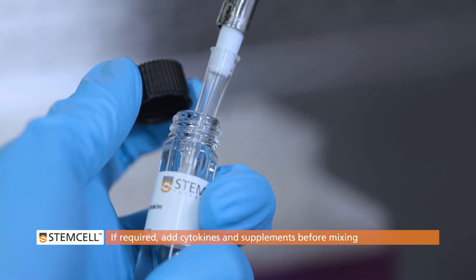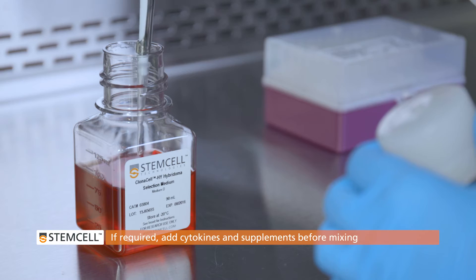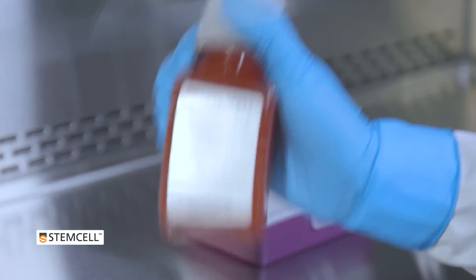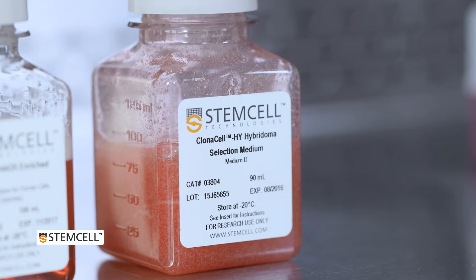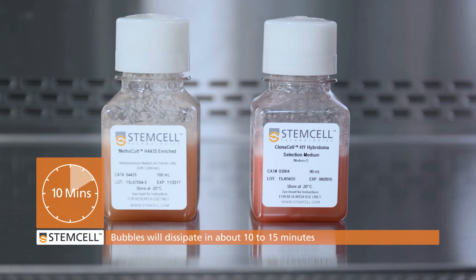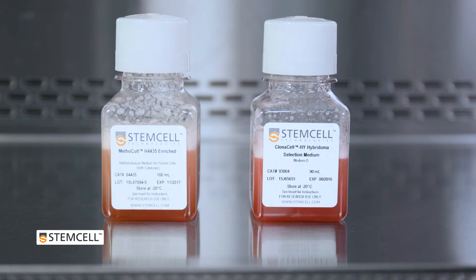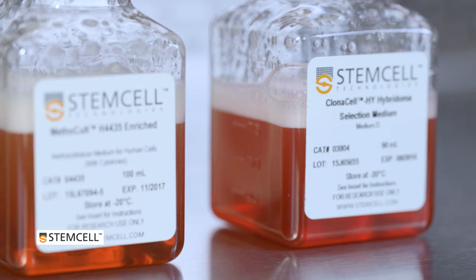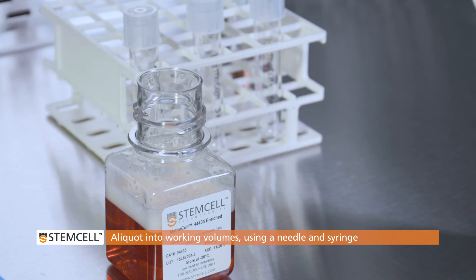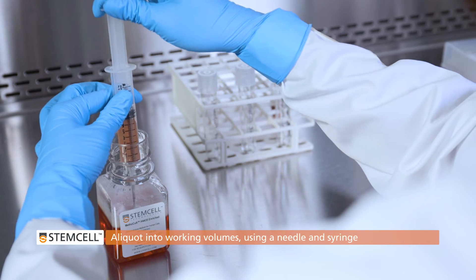If required, add cytokines or other desired supplements first, and then shake thoroughly. Wait for the bubbles to dissipate. Then you can aliquot the medium into working volumes using a blunt-end needle and syringe.